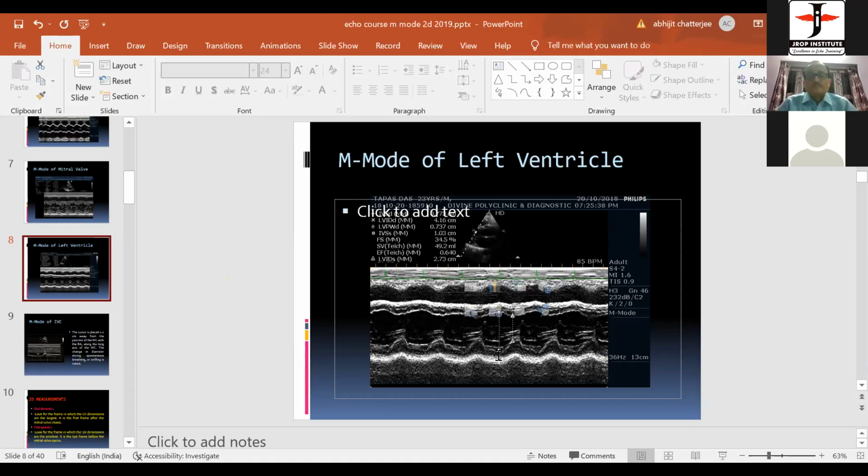Dr. Shashank Prabhu Desai. Good evening, sir. I just want to ask, in M mode for LV dimensions, how do you avoid measuring from the LV internal diameter at the end towards the posterior wall? Sometimes we get the papillary muscle or trabeculations.